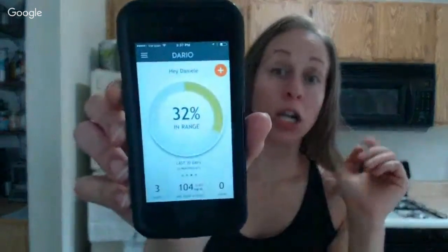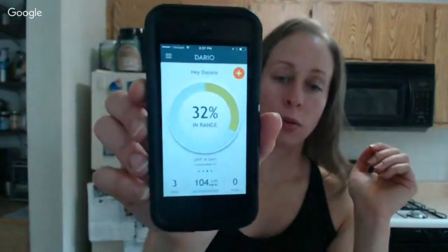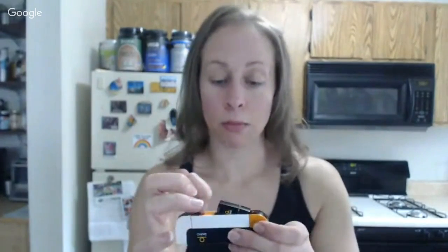So back to the main screen. Here we go. I'm actually going to do a test and show exactly how it works. So here's the main screen. What I'm going to do is pop the meter up. It comes right out. You're going to plug it right into the earphone jack of your phone. So phone, earphone jack right there.